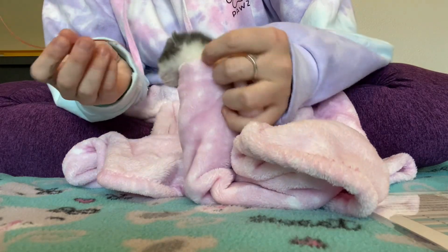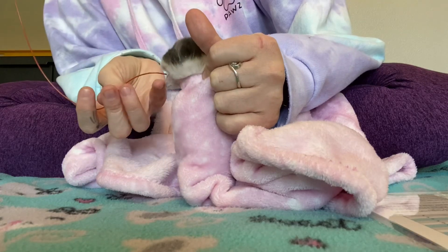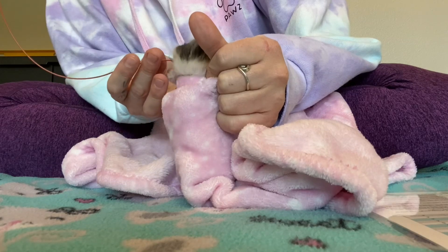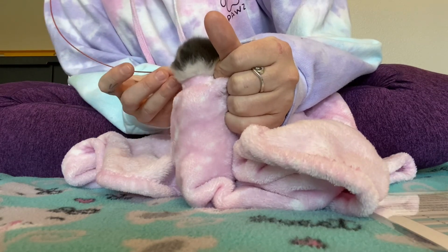Now, here you can see that I inserted the tube and I started to get some pushback, so I took it back out and I'm going to try again. I actually want him to be yelling and screaming because that way I know I am going down the esophagus. So it's a good thing if he is yelling.